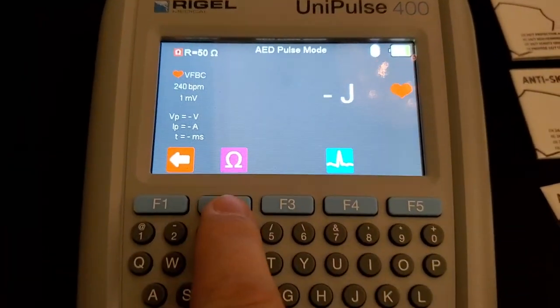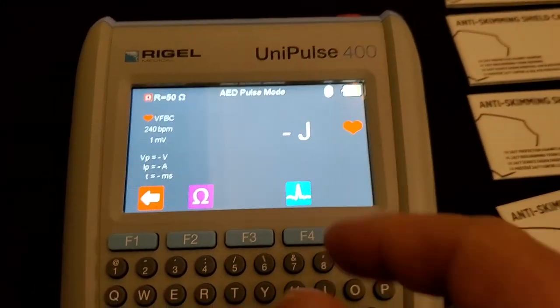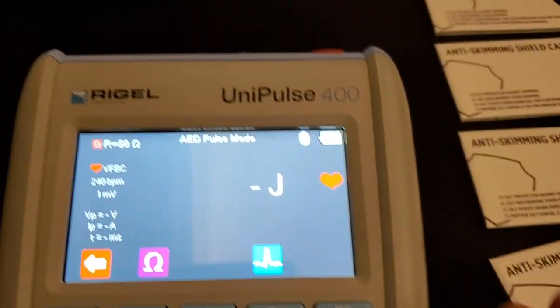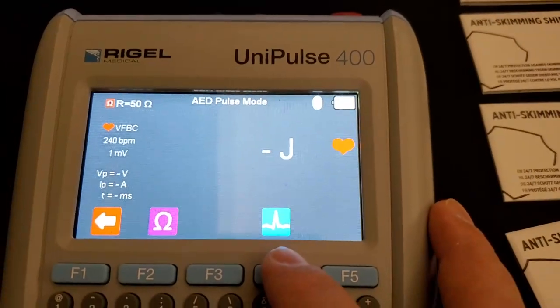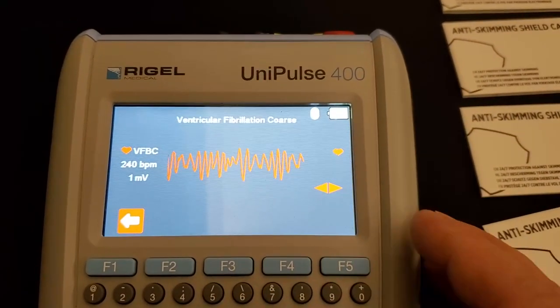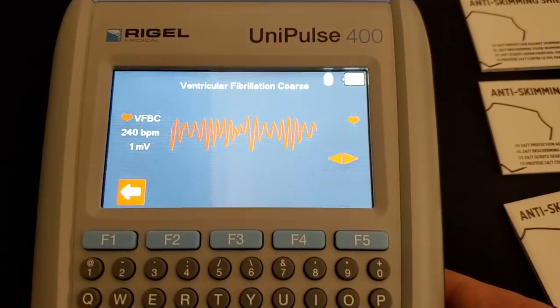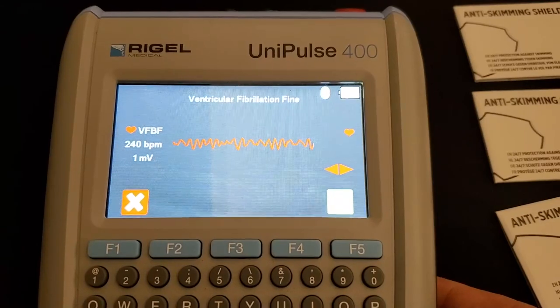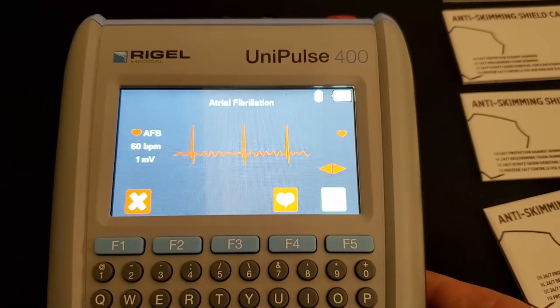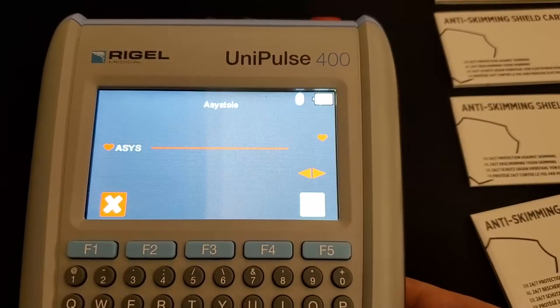And you can adjust your load. But when you test AEDs, one of the things that is always a pain on these analyzers is flopping through regular sinus rhythm and then flipping into an arrhythmia to get it to shock. So you can see right here it's got a graphical representation of the arrhythmia — you can flop through it and see if your AED is going to shock. How cool is that?